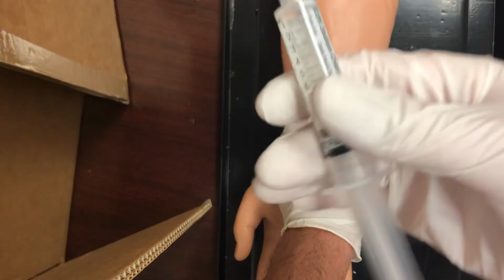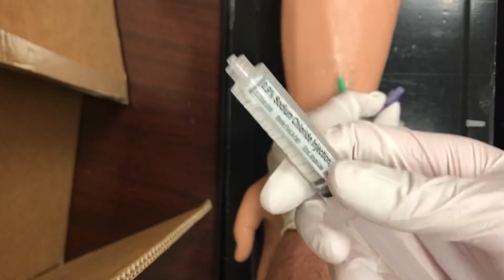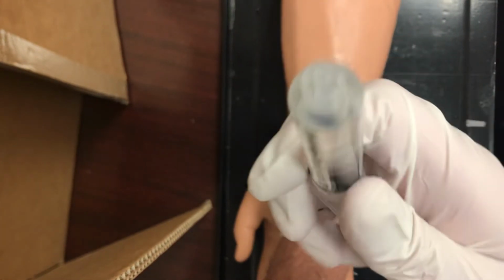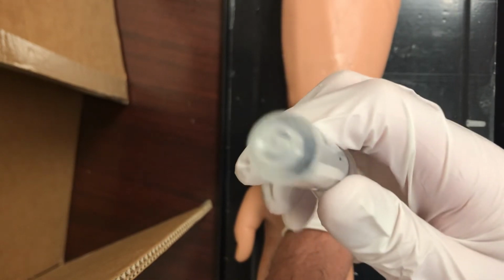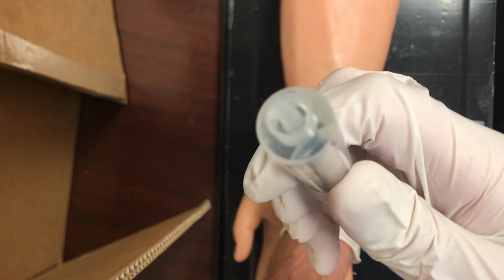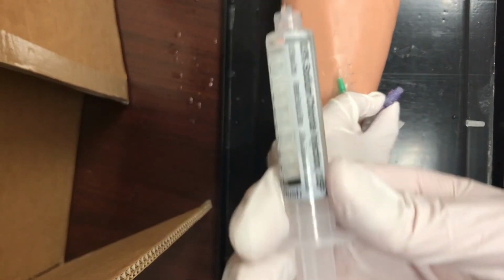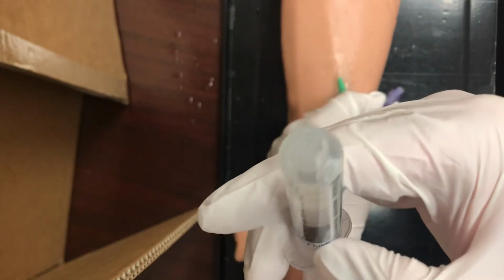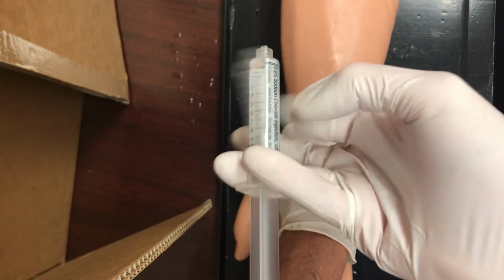For this, we're going to make sure we get all the air out. I don't know if you can see the air pocket there. We're going to take the air out of this syringe. The way to do that, there's a seal up top here. So what you do is aspirate by pulling back on the plunger, holding that straight up, pulling back a little bit, and I'll break that seal. It's going to push the air out of the syringe, making a little bit of a mess there. If it does, you can flick it and make the needle go to the other end, so that way it's clear up top.